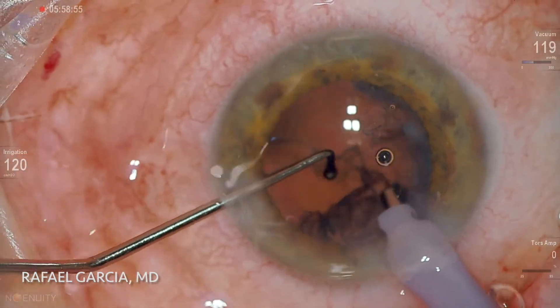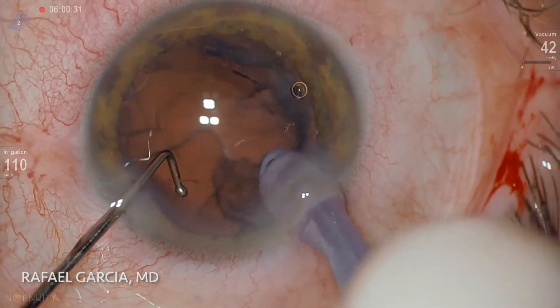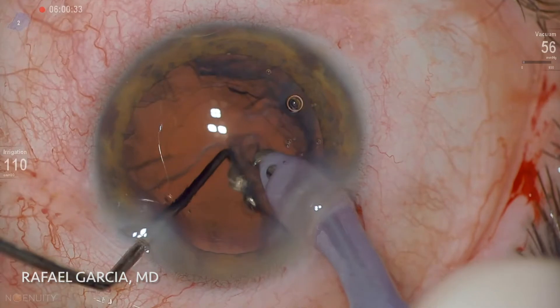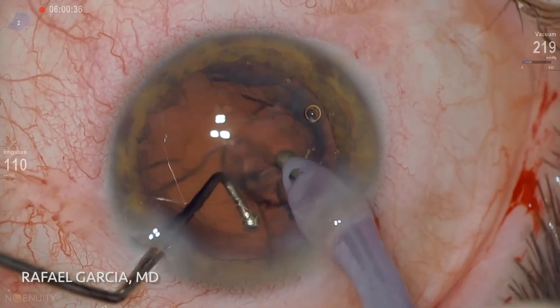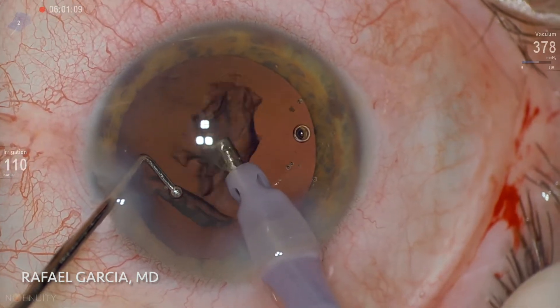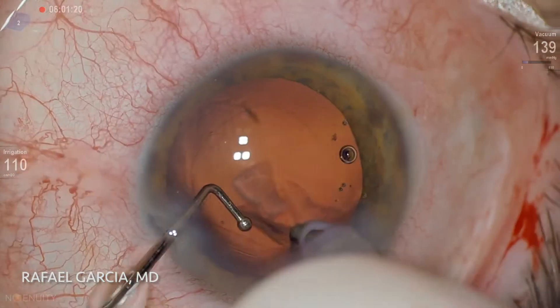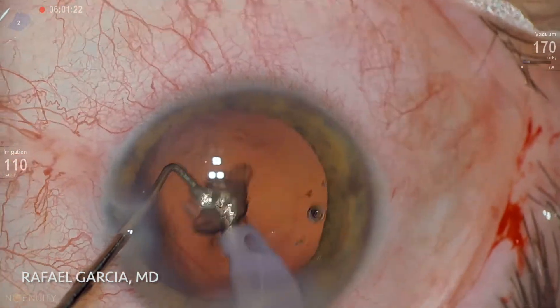Nice and easy, this epinucleus shell is aspirated, and now comes the IA probe to complete the removal of the lens material. I prefer to address the subincisional cortex first and then go 360 degrees around the capsular bag and thoroughly clean it of any cortex. There was one last piece hidden subincisionally, but it's readily taken care of.